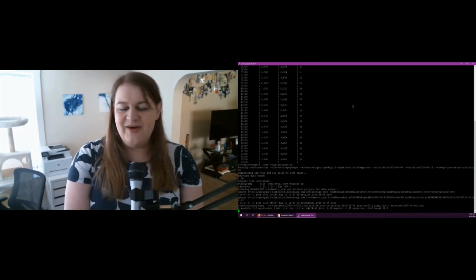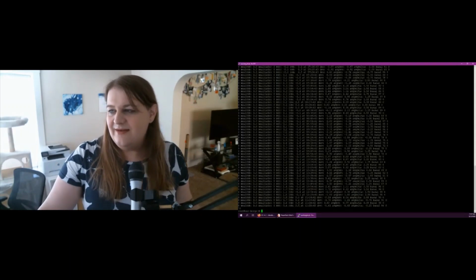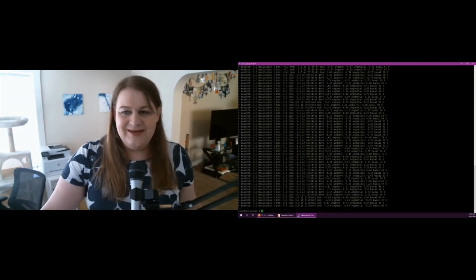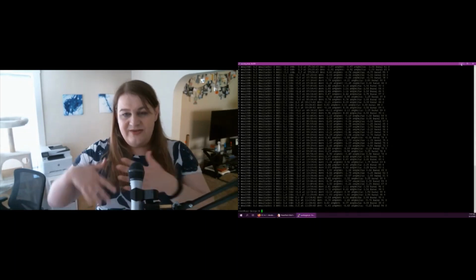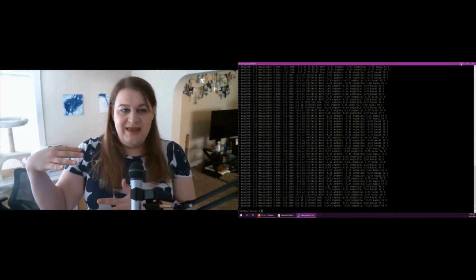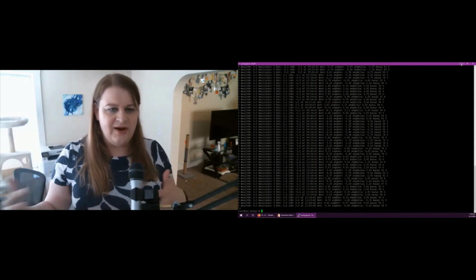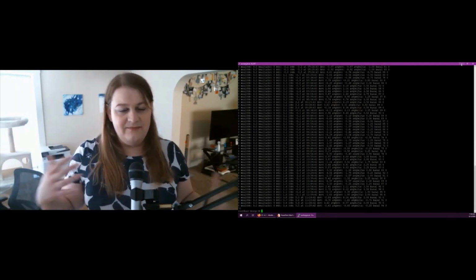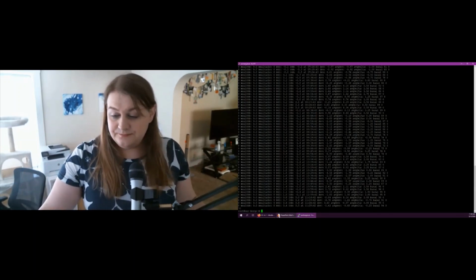And then there's some other variables in here. I'm not going to dump those out because they have some passwords and security keys. But there's some variables I can tinker with in here. Just tell it what's the maximum amount of insulin to give me at any moment, or how liberal should it try to do these corrections. So there's a lot of safety measures in there too, which I really like.